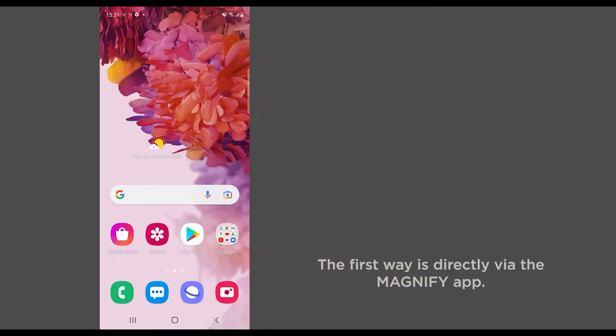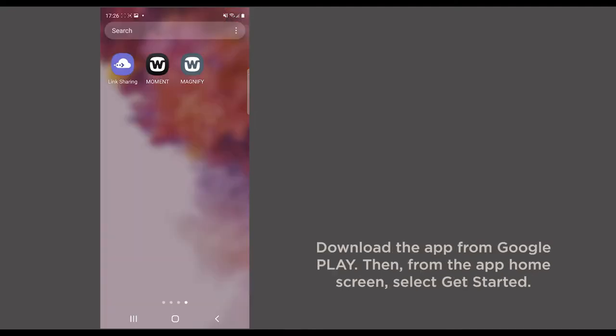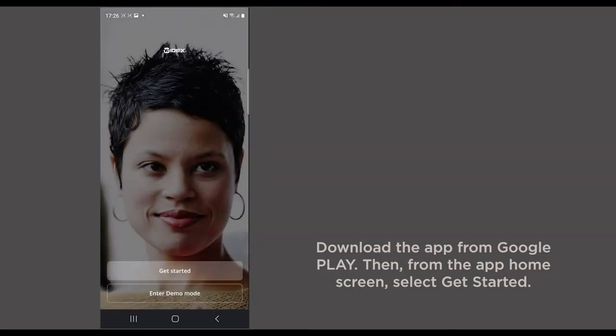The first way is directly via the Magnify app. Download the app from Google Play. Then, from the app home screen, select Get Started.